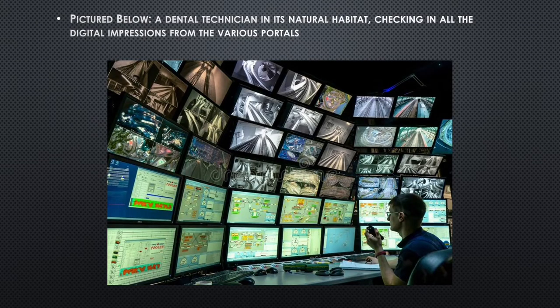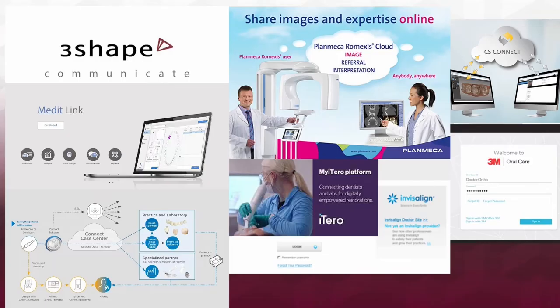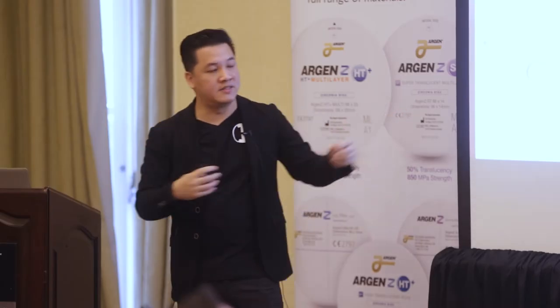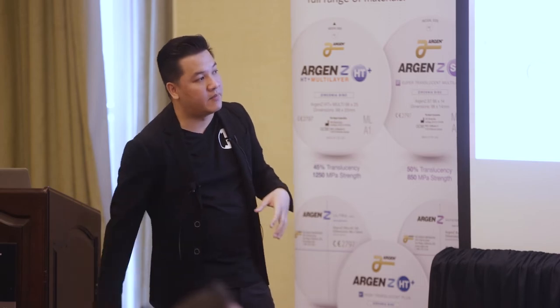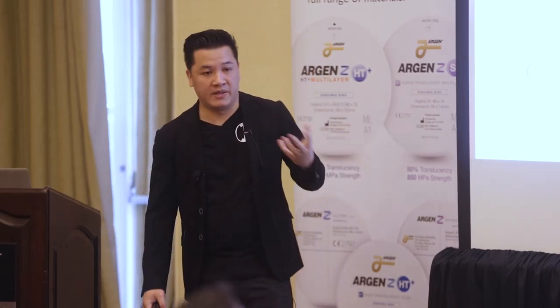And on our next step on our tour here, ladies and gentlemen, you see the dental technician in its natural habitat checking in cases from all the various portals. So if you're anything like me, I'm sure you feel this pain. There's all these different kinds of portals up in the cloud that organize all this data. It's just a huge bottleneck. So for us, what we did was we hired one person just to take care of that. But the nice thing is most scanners will output an STL or a PLY file, which is the de facto standard. So if they can at least do that, then you'll be able to work with these.